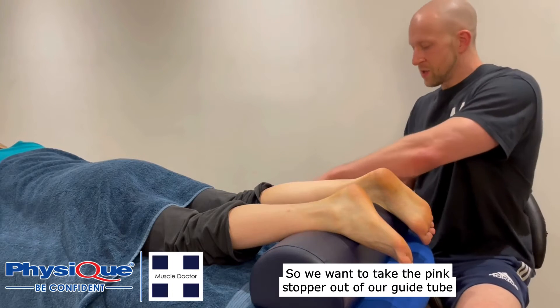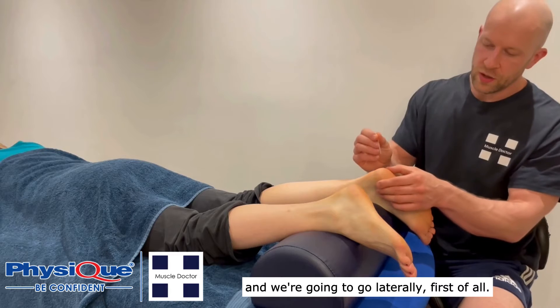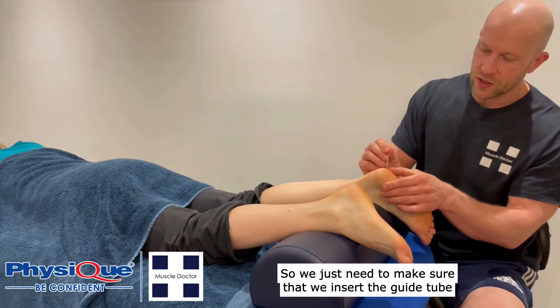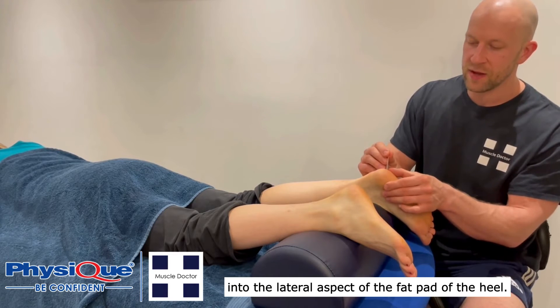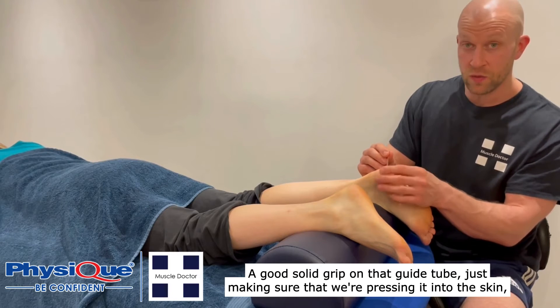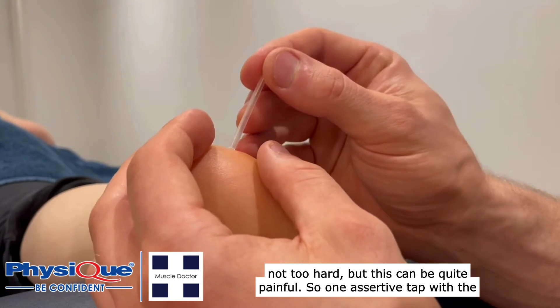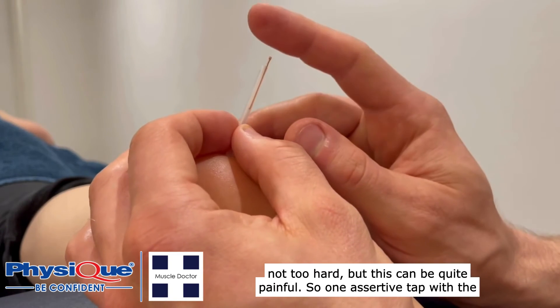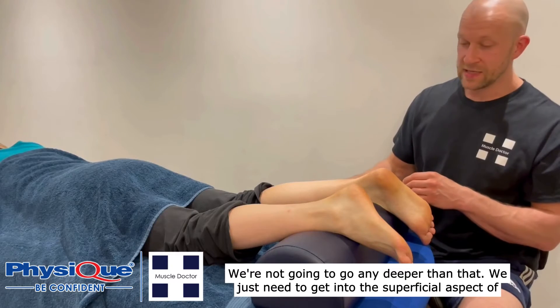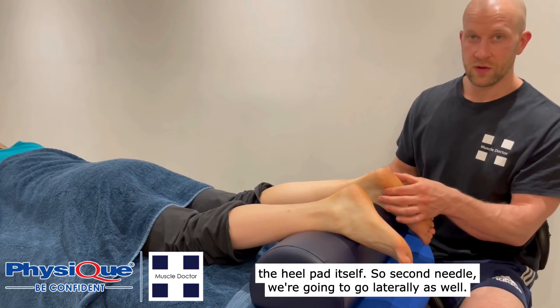We want to take the pink stopper out of our guide tube and we're going to go laterally first. We just need to make sure that we insert the guide tube into the lateral aspect of the fat pad of the heel. A good solid grip on that guide tube, making sure that we're pressing it into the skin — not too hard, but this can be quite painful. One assertive tap with the needle and then we can remove the guide tube. We're not going to go any deeper than that; we just need to get into the superficial aspect of the heel pad itself.